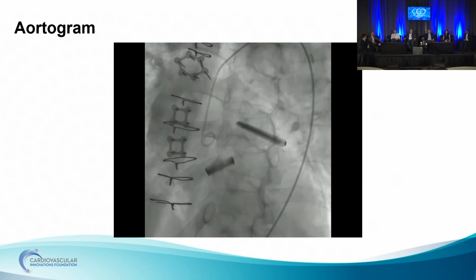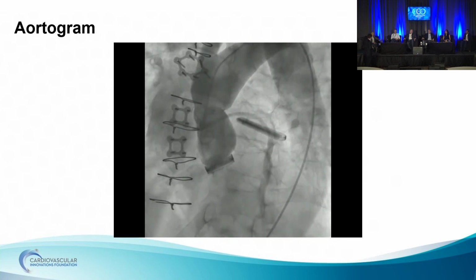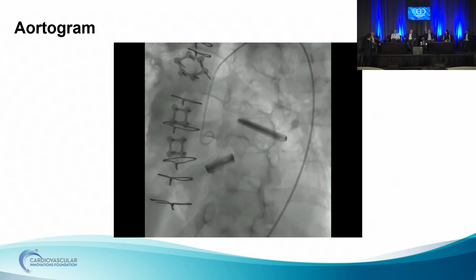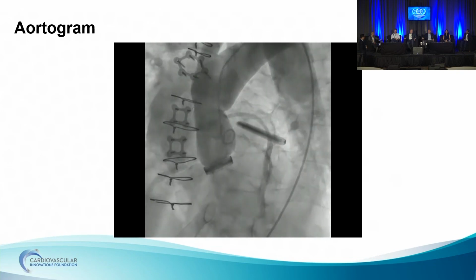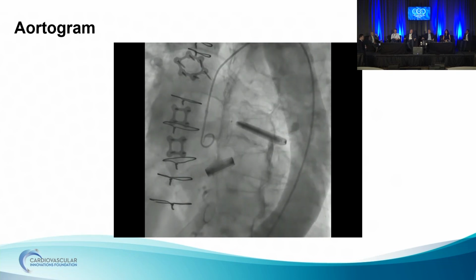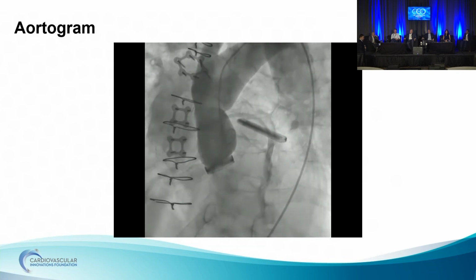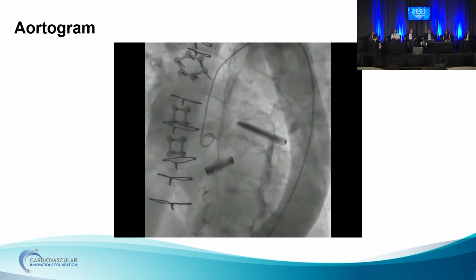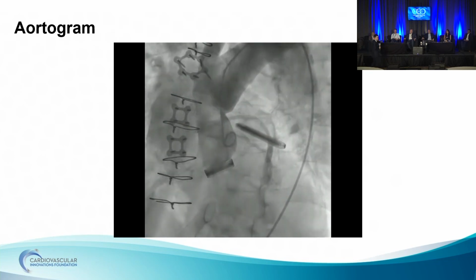My second question is, how do you start? Do you just go with the pseudoaneurysm, RCA, and then leave everything else alone? Do you try to tackle everything? Fix his vein graft first. Do everything in the same stop and... all right, so pseudoaneurysm's probably been there since day one. That's not why he's presenting to you right now. The culprit is the vein graft. Yeah. Well, we thought we should start, we agree. So we thought we should start with the SVG first, see what's happening there, if it's truly compressing or not.